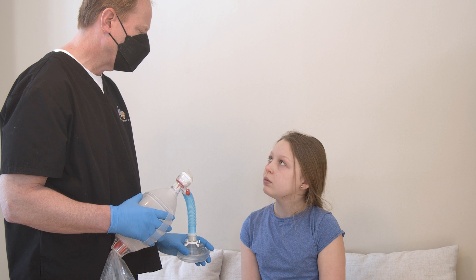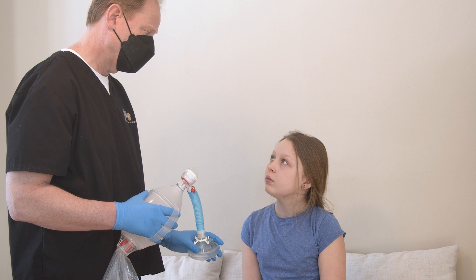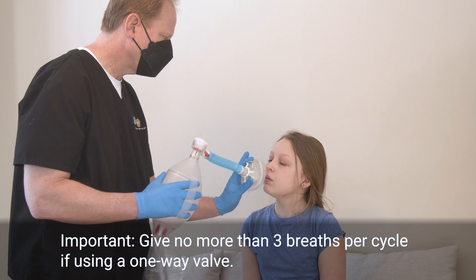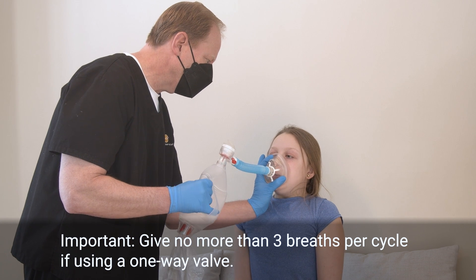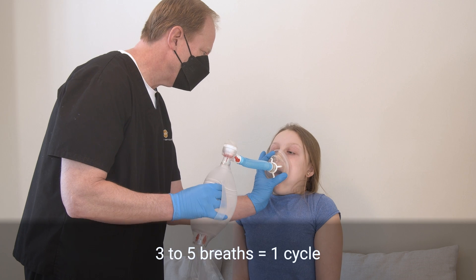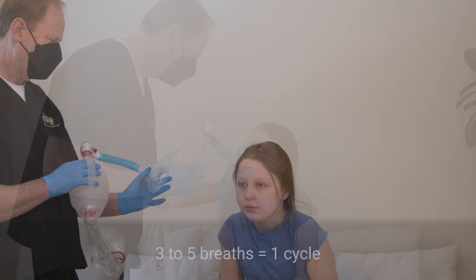If your child is able, ask them to hold their breath as long as it is comfortable between each resuscitation bag breath. When they exhale, ask them to use the air to cough. Squeeze the resuscitation bag to give three to five big breaths in a row. This is one cycle. Most children receive three to five cycles twice a day.